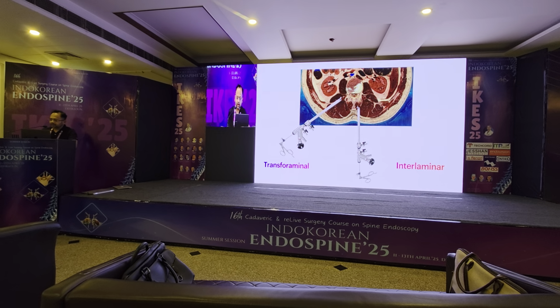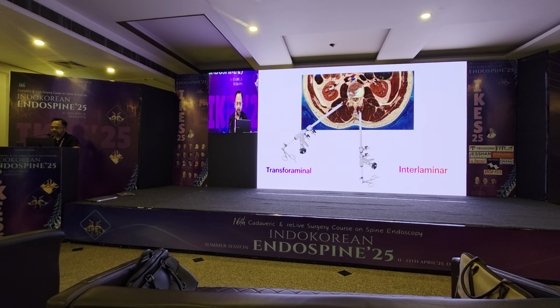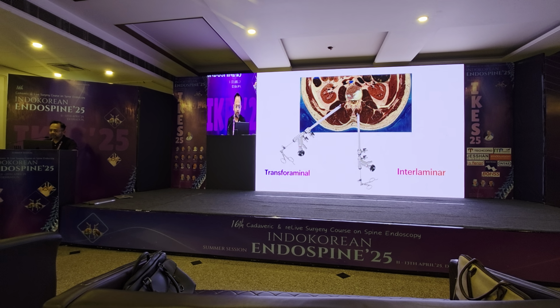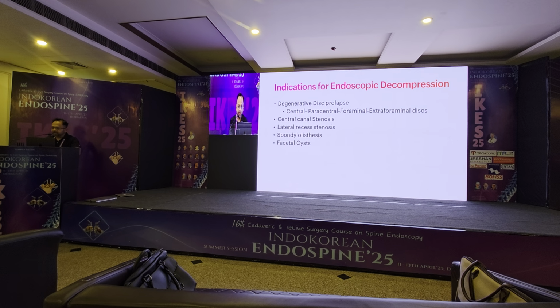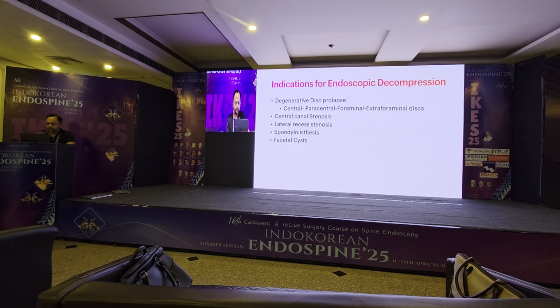So as I told yesterday, there are only two routes of endoscopic spine surgery. One is the interlaminar route or a stenosis route. It can be uniportal or biportal. The other is a transforaminal route. Indications, I think you have seen most of the indications are taken up nowadays.